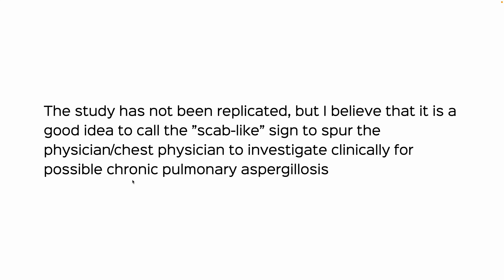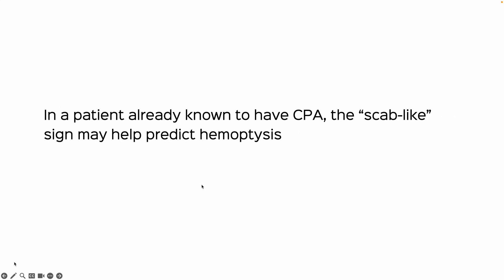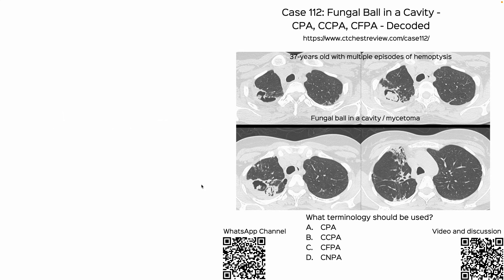I believe it's a good idea to look for these mural or wall lesions or excrescences and call the scab-like sign in the report, to spur the physicians to investigate clinically for possible chronic pulmonary aspergillosis. In patients already known to have CPA, this may help predict hemoptysis. I did a post on this at ctchestreview.com on Sunday, in case you're interested.